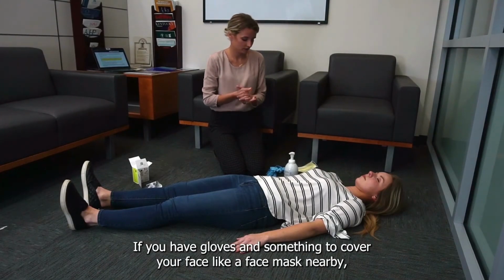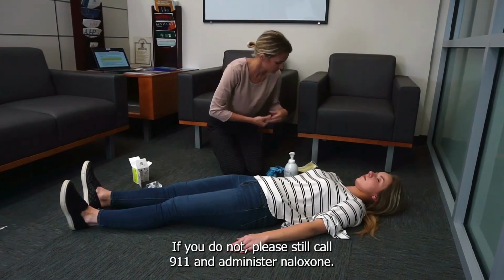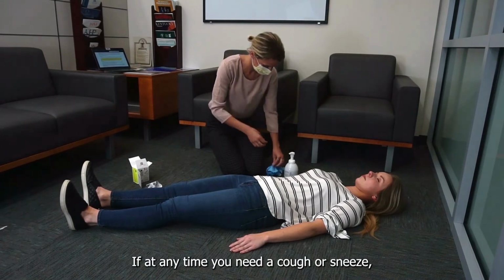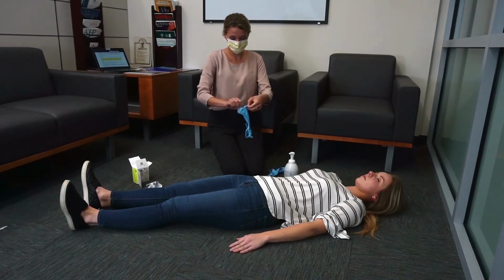If you have gloves and something to cover your face, like a face mask nearby, please put those on. If you do not, please still call 911 and administer naloxone. Wash your hands or use hand sanitizer if possible. If at any time you need to cough or sneeze, do that into a tissue or into your sleeve or arm.